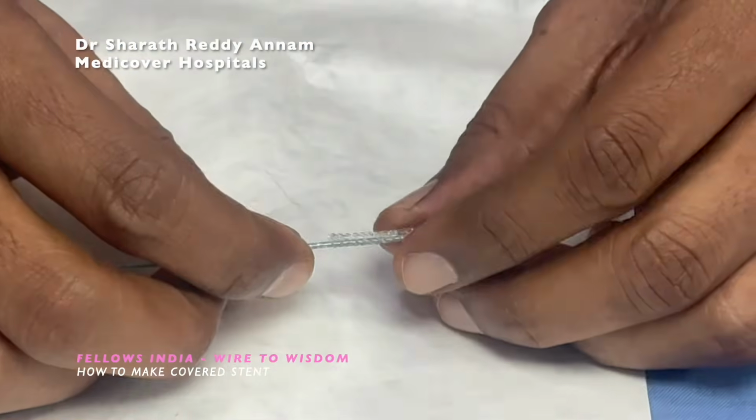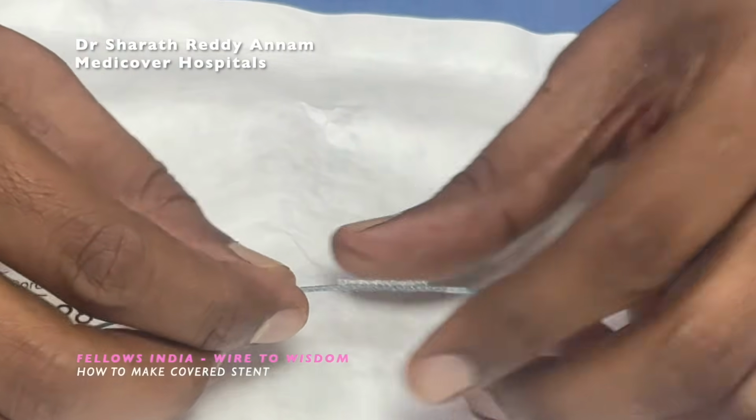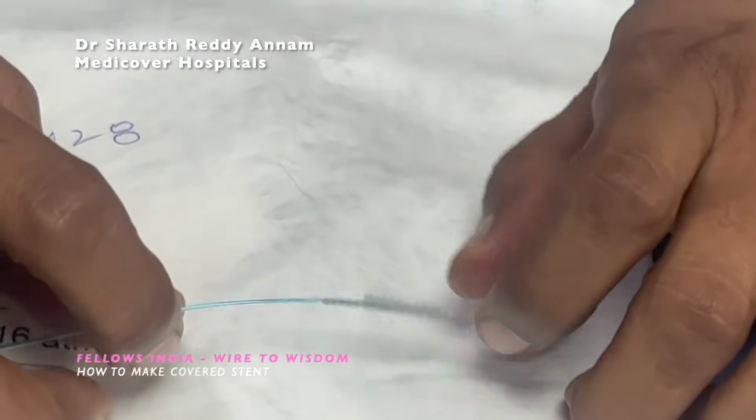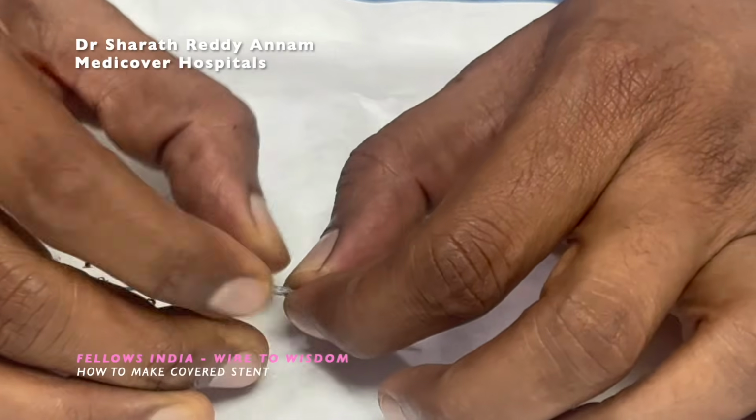Introduce your longest stent onto this stent, and now this acts as a covered stent. You can crimp your outer stent on the inner.